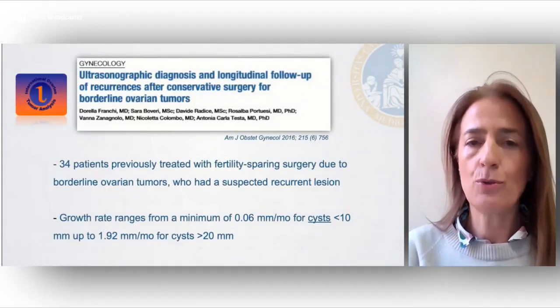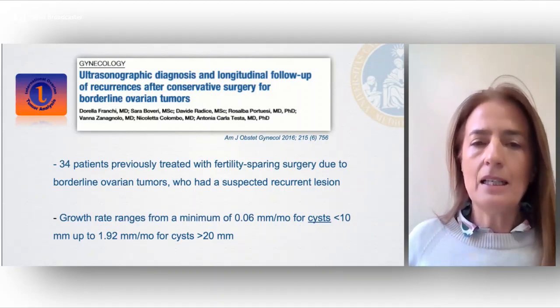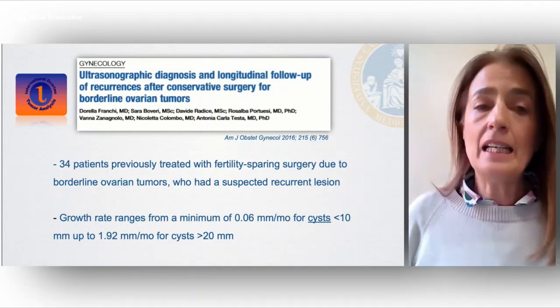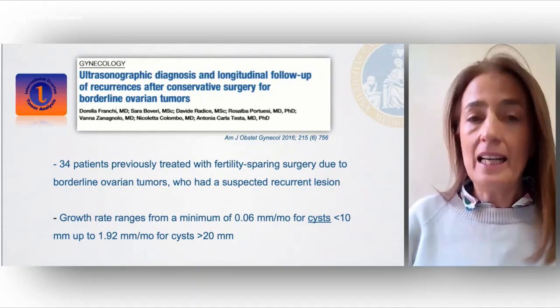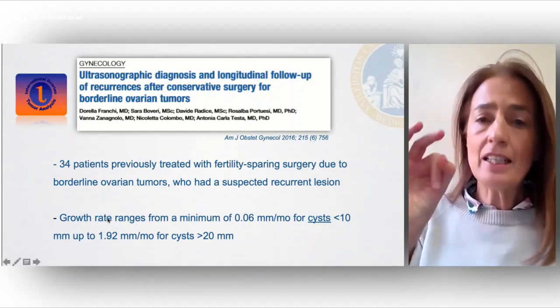We usually also test CA125, but it's not so useful. We do that keeping in mind that an eventual recurrence is clear and easy to detect by using ultrasound.